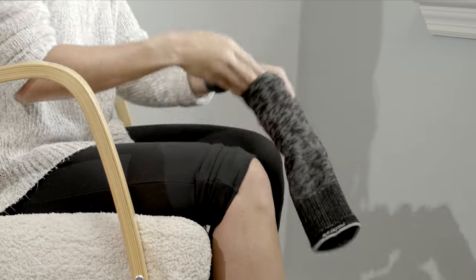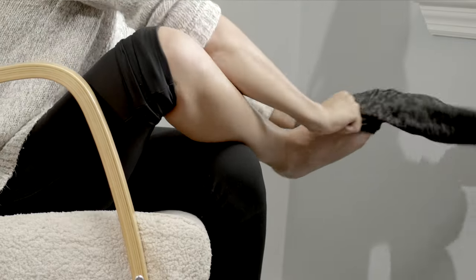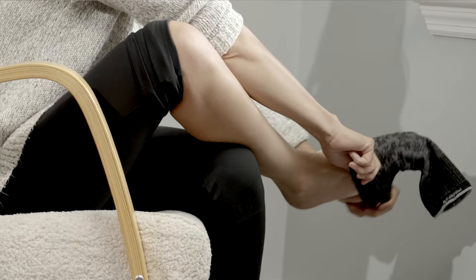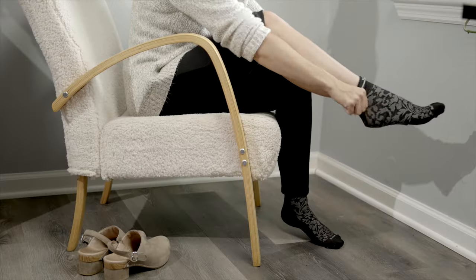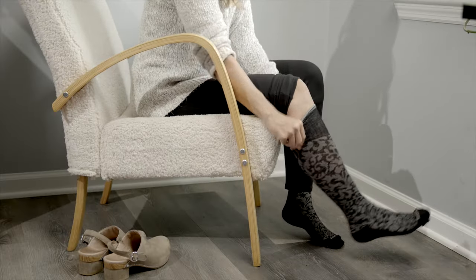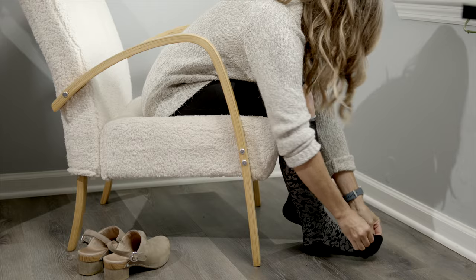Flip it over. Slip the sole of your foot into the sole of the sock, aligning the toes and heel of your foot into the sock. Pull the leg of the sock over your calf and voila! You've easily put on your Sockwell Compression Sock.